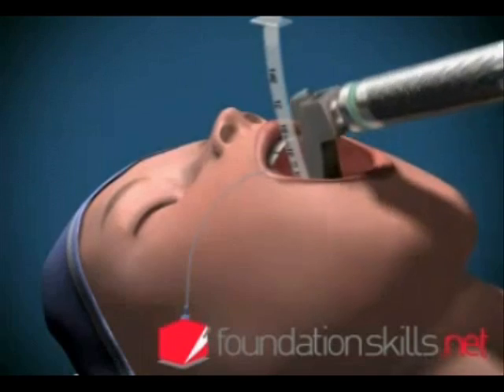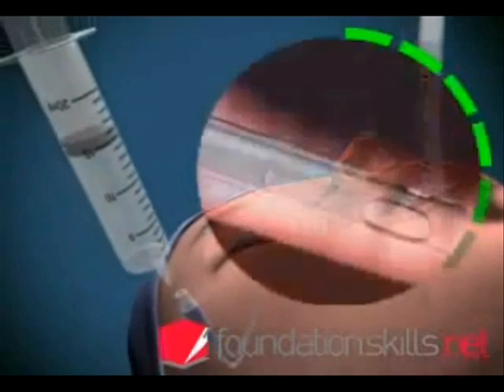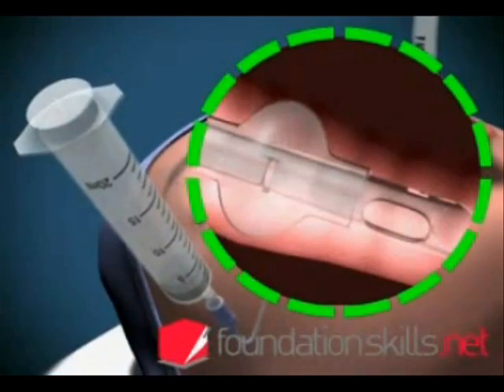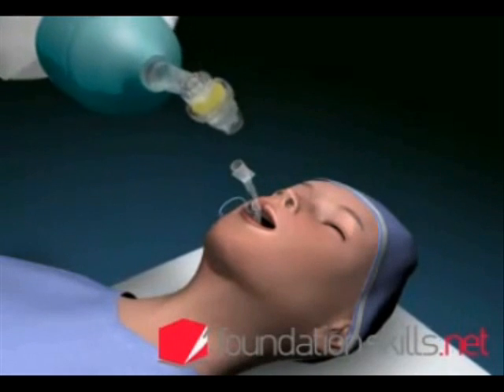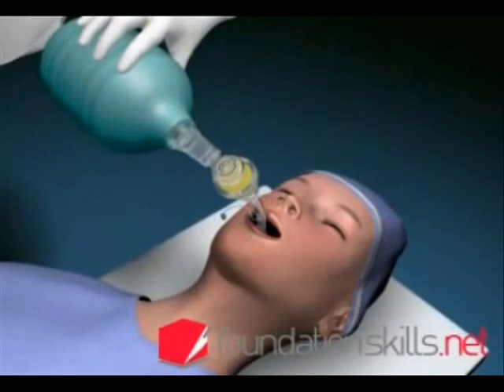Remove the laryngoscope and inflate the cuff with approximately 15 ml of air to prevent air leaking during ventilation. Attach the tube to the bag and valve apparatus and ventilate the patient with the oxygen flow on 12 to 15 liters per minute.